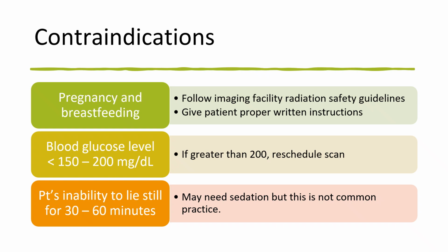You would want to give it about 20 minutes or so before you start imaging them so that it has time to kick in. This is really not a common practice. Most of the time, patients are going to be able to just lay down and lay still, or you can work with them with guides and things like that to help remind them to hold still. So it would be a very, very rare occasion that you would need to sedate a patient for this test.